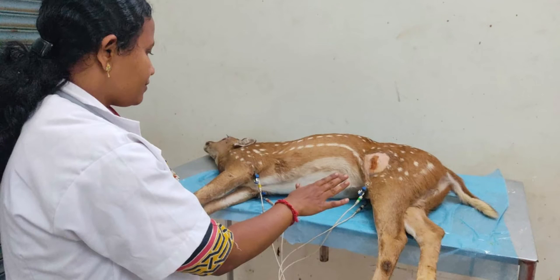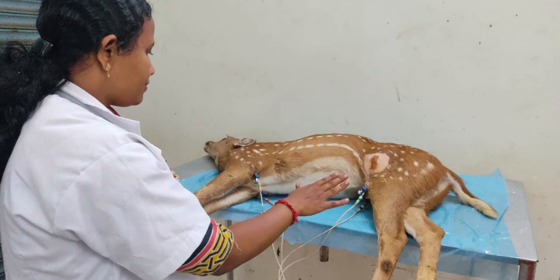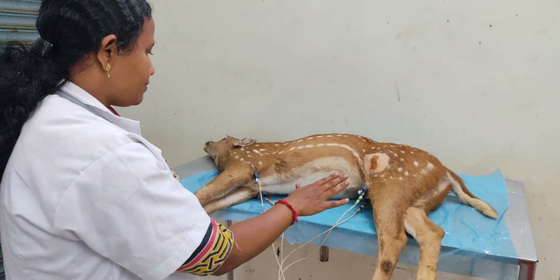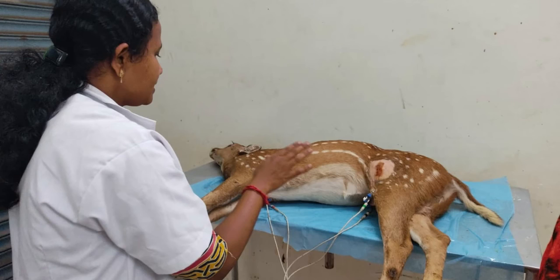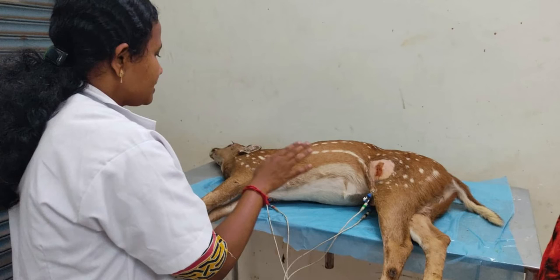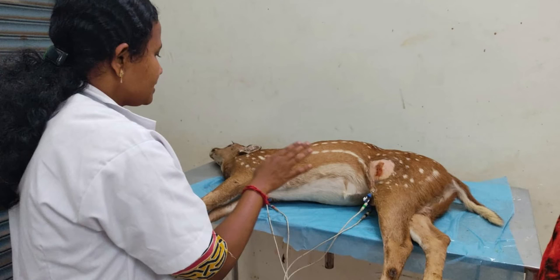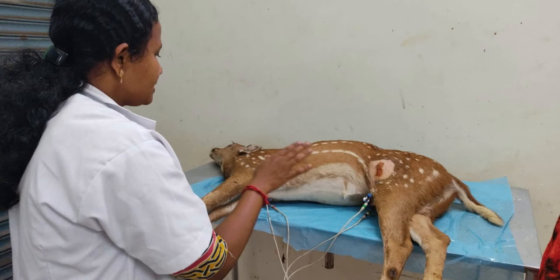For ECG recording in rescued deer, the recording can be done using either the base-apex lead, standard bipolar limb leads, or augmented unipolar limb leads. However, the base-apex lead provides the most uniform ECG pattern and higher mean amplitudes compared to other standard limb leads.